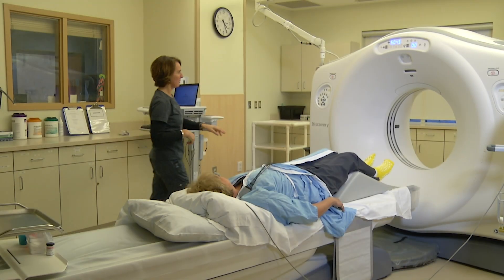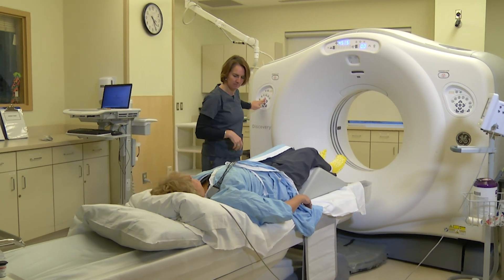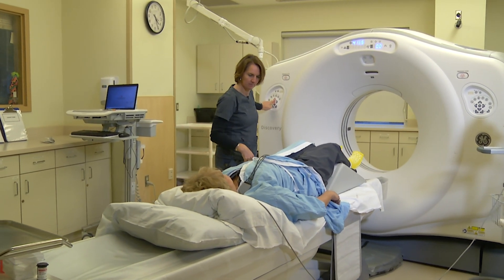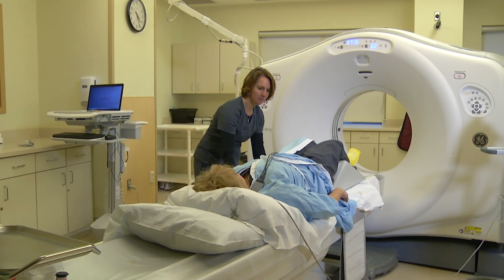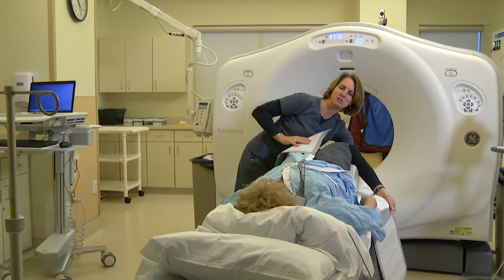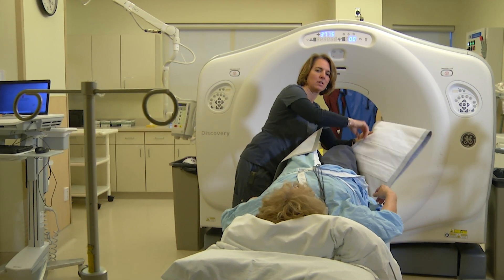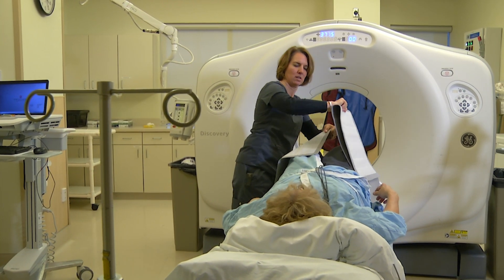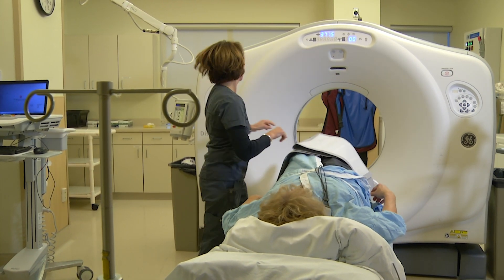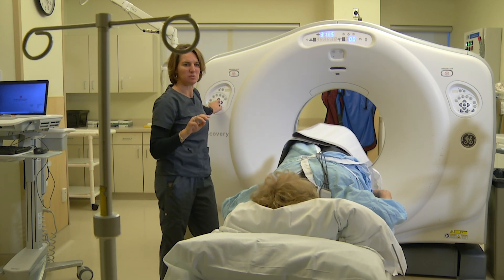The CT machine itself looks like a giant donut made of metal and plastic. In order to do cardiac CT, the patient has to lie down on a table. The technician will use pillows or straps to keep him or her in the right position. The patient will be connected to a heart monitor and an IV will be put in place.